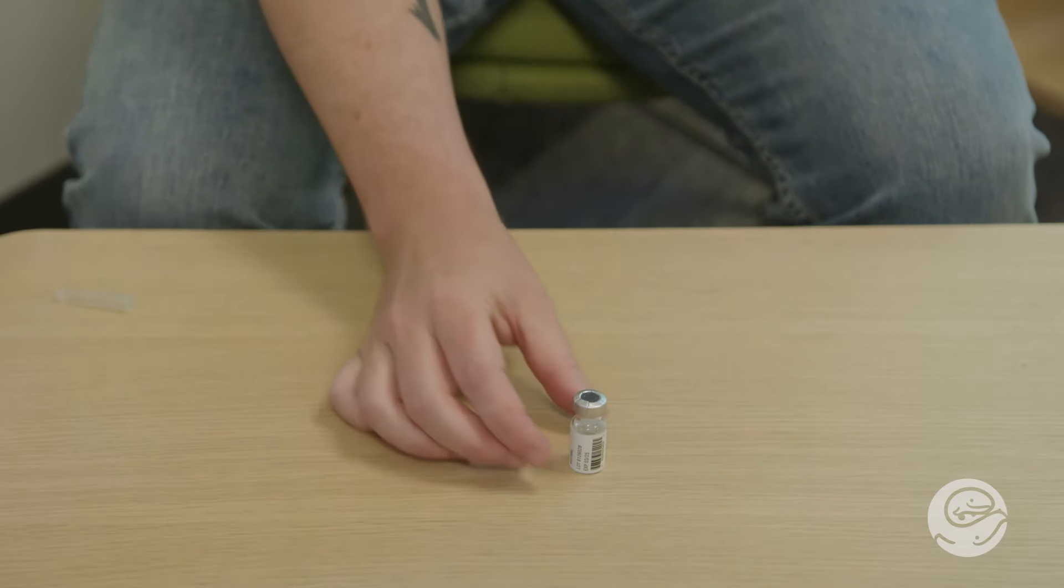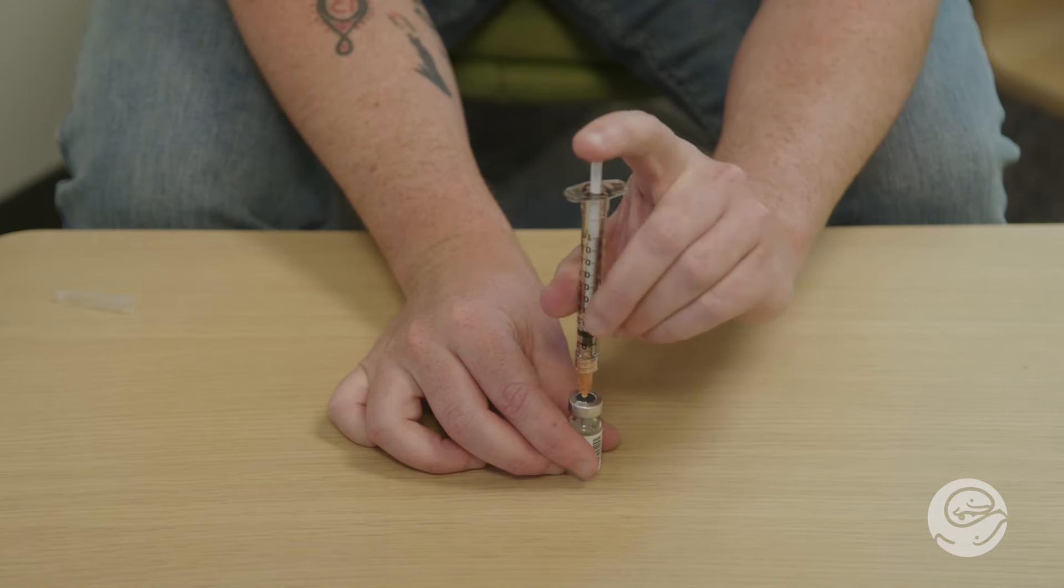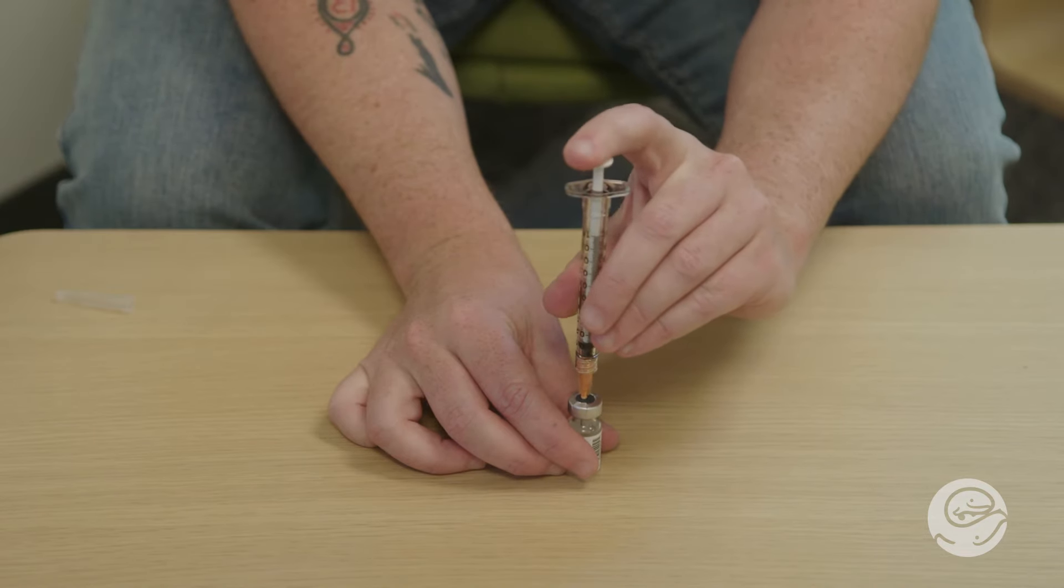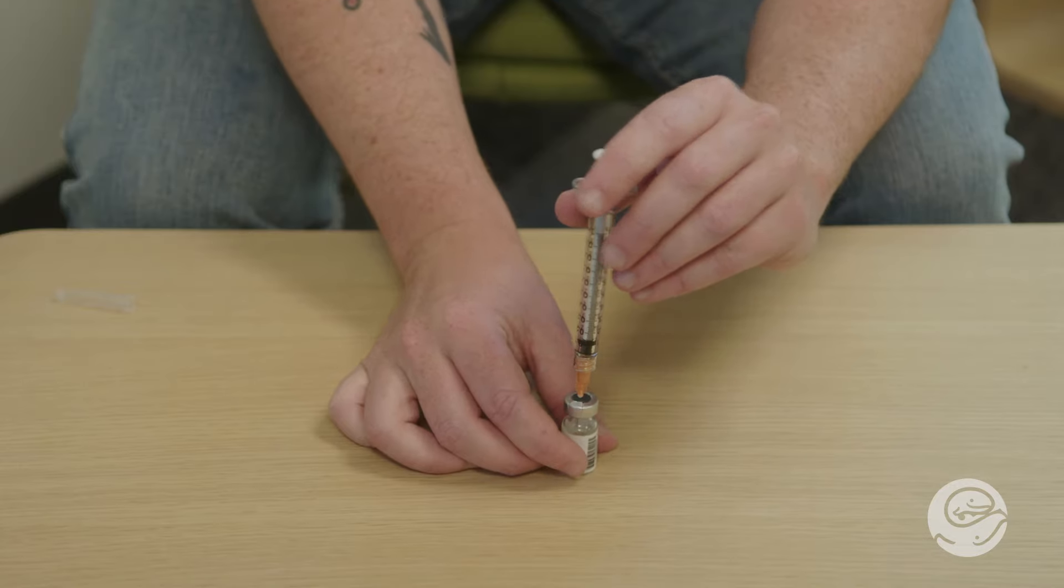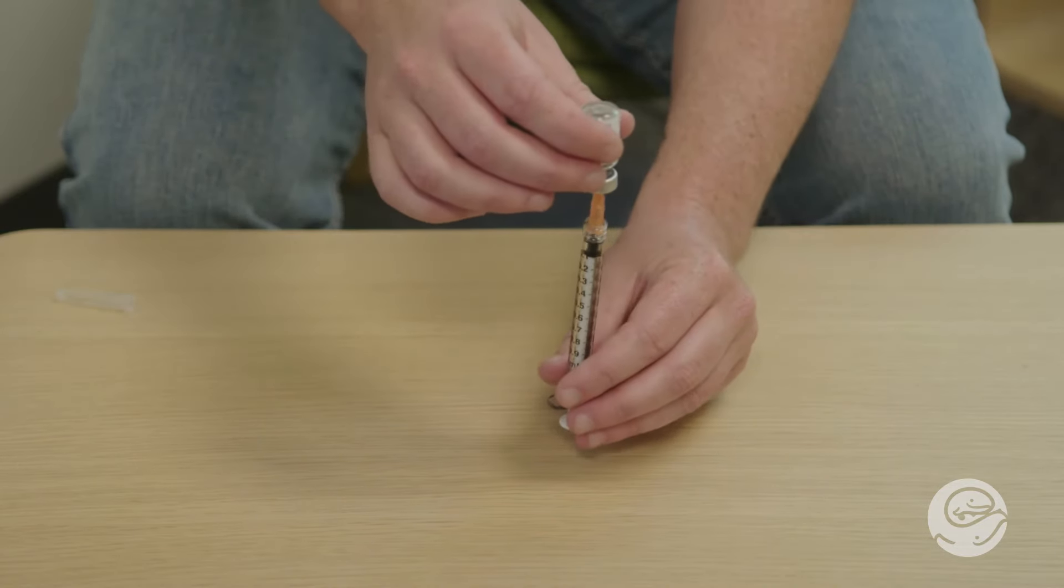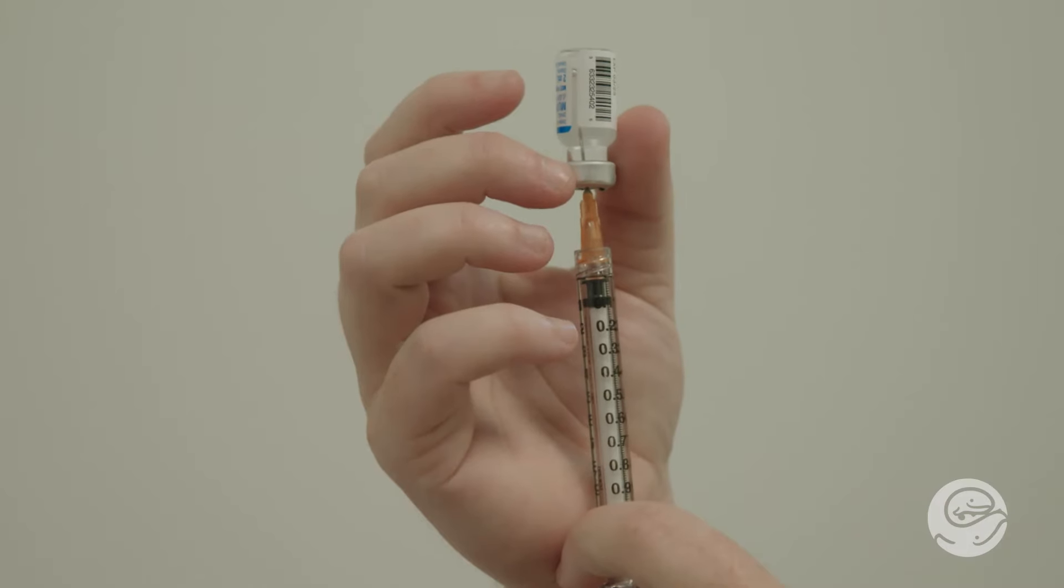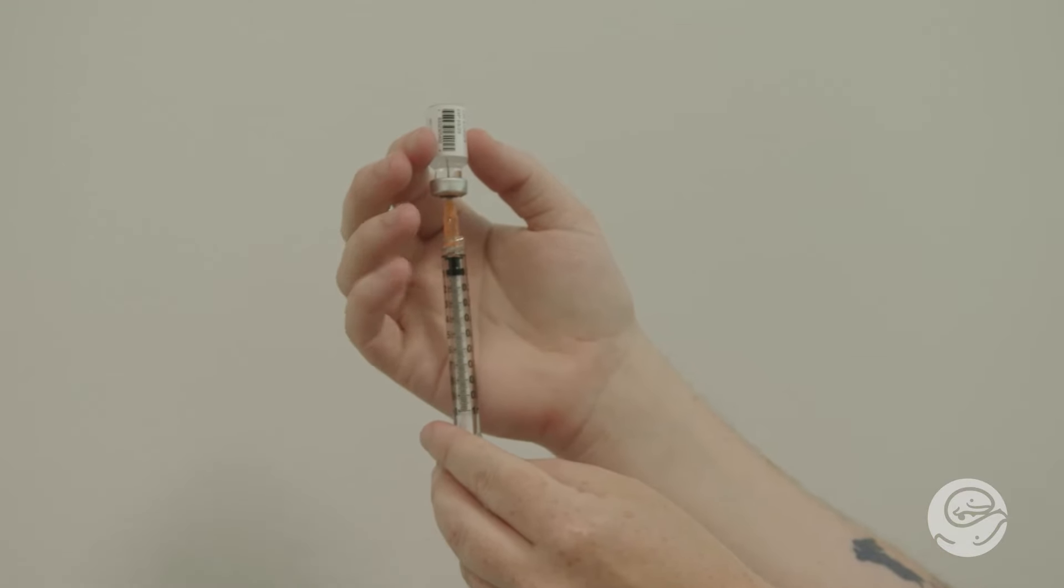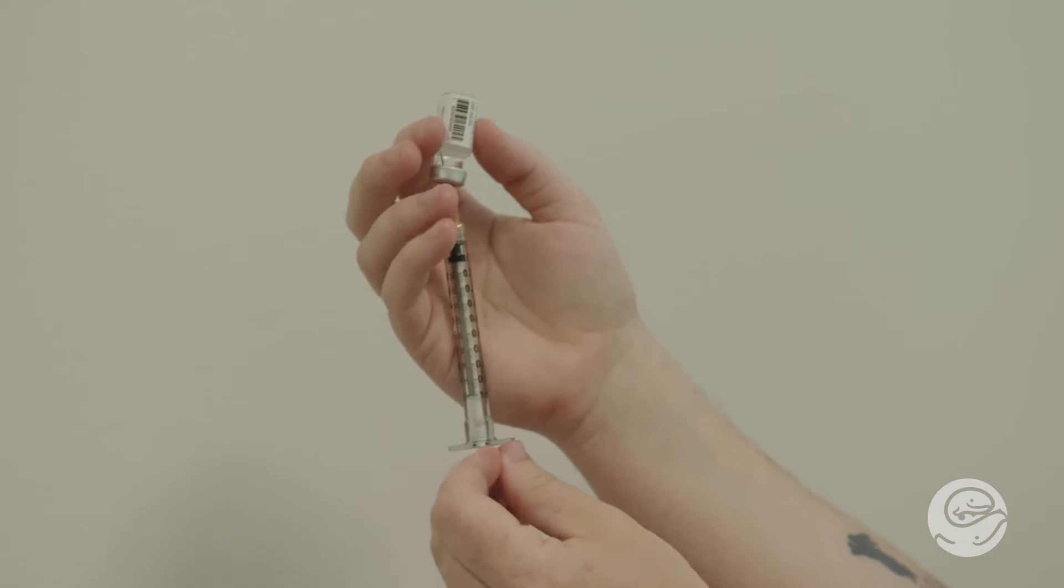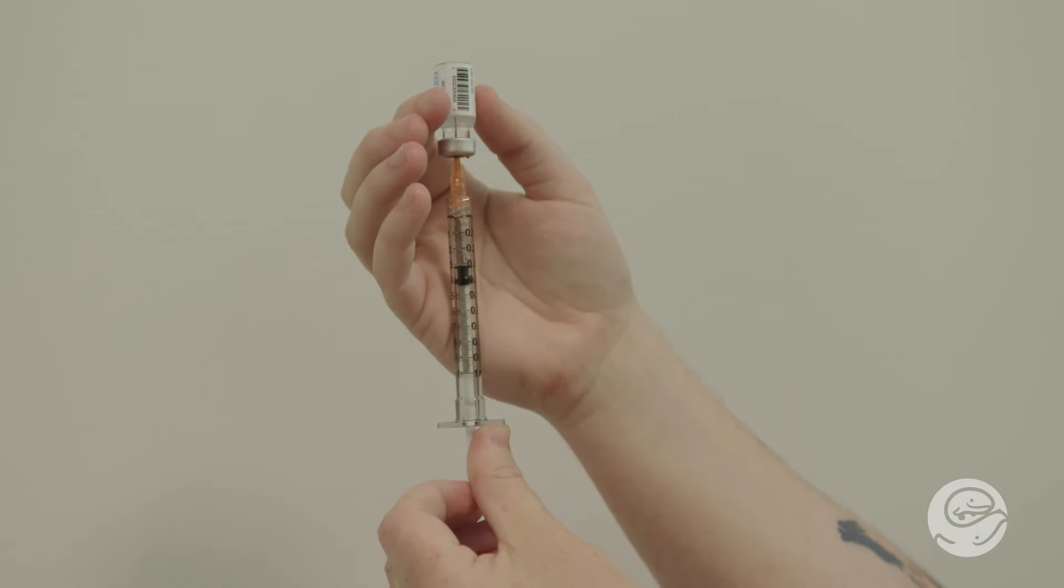Now that the needle is uncapped, hold the vial steady on your surface and insert the needle straight down into the medicine through the rubber part of the cap. Push the air into the vial. Holding the vial in one hand and the syringe in your other, turn the vial upside down. Look to make sure the tip of the needle is in the medicine and pull back on the plunger to draw up your dose. These medicines are thick and go slowly into the syringe through the thin needle. There is no rush. Pull back evenly on the plunger to pull the medicine into the syringe.